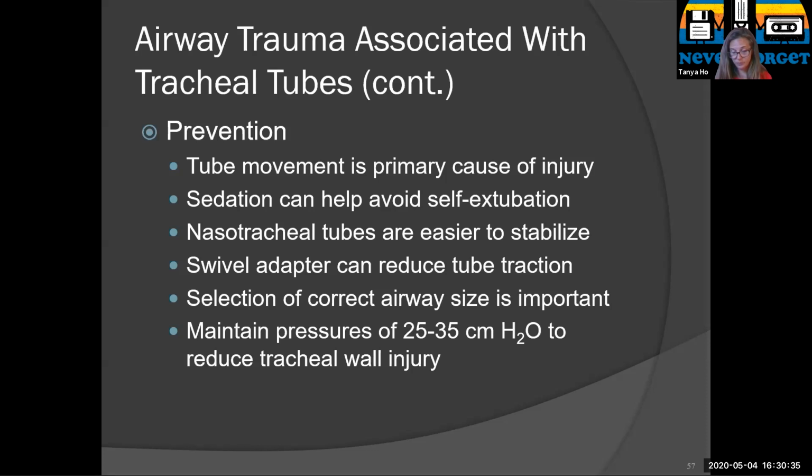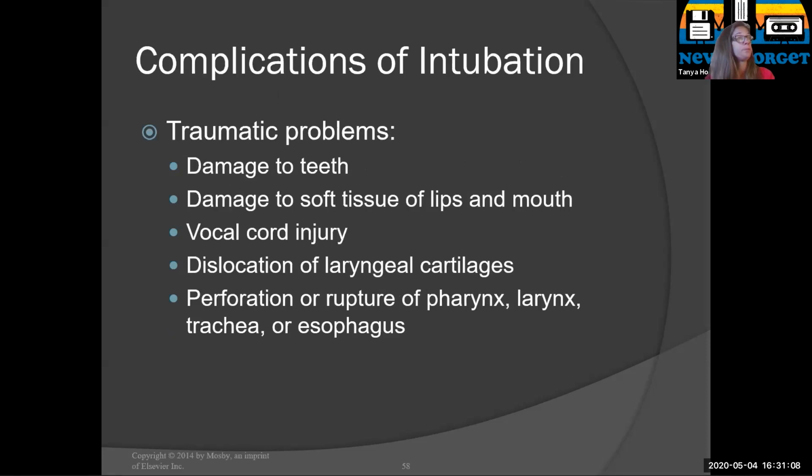males and females. Okay, so again, high cuff pressures compress the little capillaries on the tracheal wall. That leads to tracheal cells dying, necrosis, and that can lead to a whole bunch of problems. So that's why we want to make sure that we don't create permanent damage to somebody's airway from having them intubated. Okay, so you have to maintain appropriate cuff pressures, enough to do what it is intended to do, but not overinflating the cuff and not having too much pressure to hurt the airway.